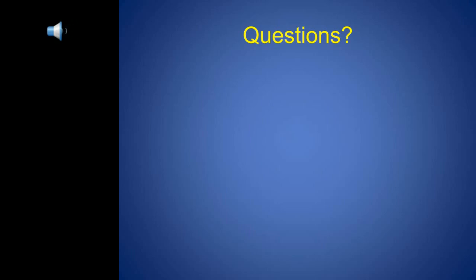And before we get started on the questions, I just want to relay the results of our poll. So thank you so much to everybody who responded. The laboratory poll question was, if your laboratory currently performs syphilis testing, which algorithm do you run? The traditional algorithm, such as screening with a non-treponemal test, RPR, VDRL, and confirming with a treponemal test, such as EIA or CLIA, and 48% of the respondents answered that.